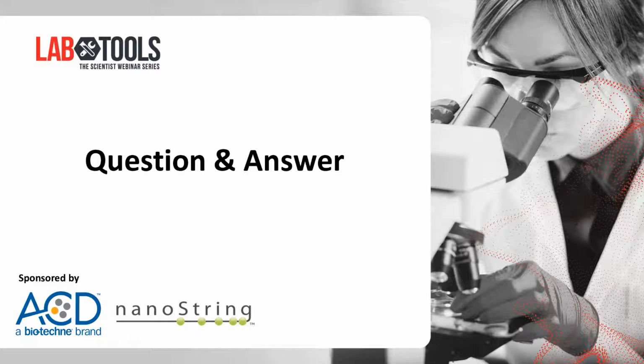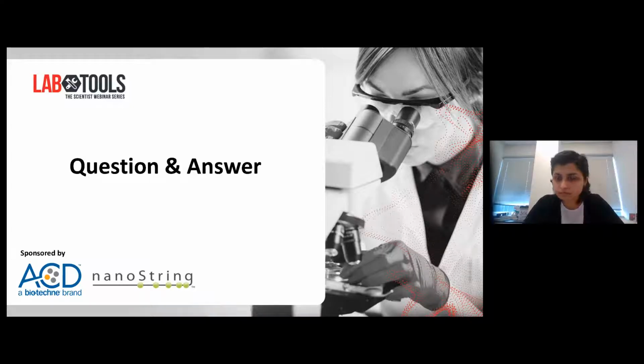Thank you very much. A question for Anushka: could you introduce the difference between RNAscope and HiPlex in their working principle, and why can HiPlex detect more genes simultaneously than RNAscope? Thank you. Yeah, that's a great question. So in principle, the HiPlex is part of the RNAscope assay technology. The name of the assay is RNAscope HiPlex. With this assay, we've expanded the capability of how many targets you can detect simultaneously.